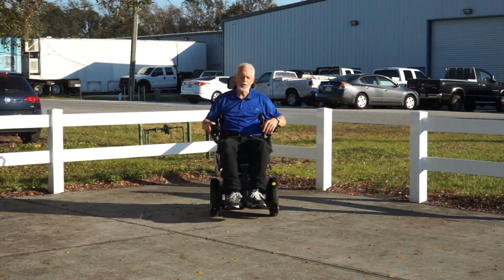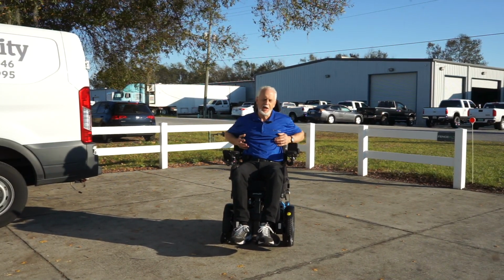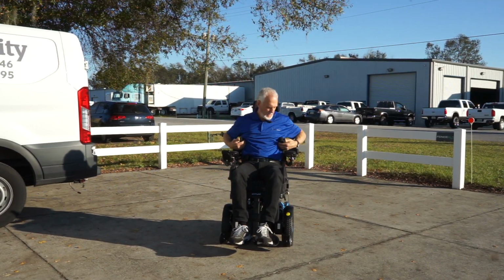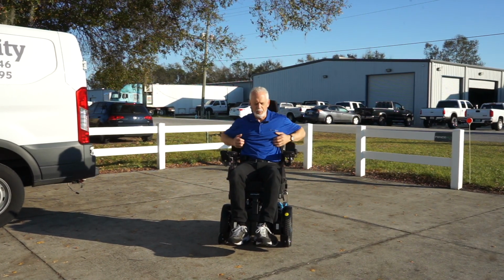If you have someone who has a tendency of leaning, well, you can't lean with this because this holds your chest right in the middle. So you're not gonna have a lean. You're not gonna be able to lean.